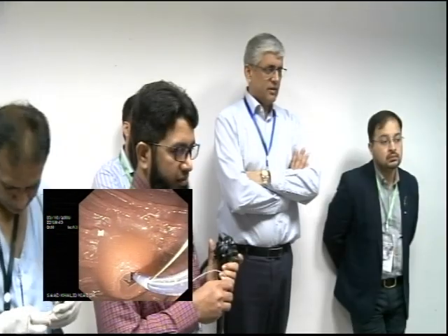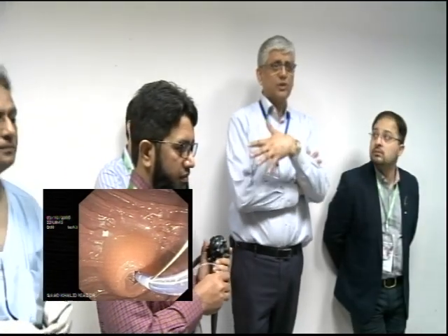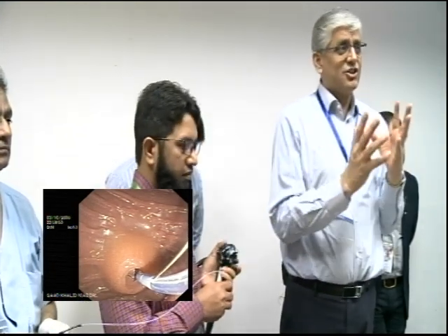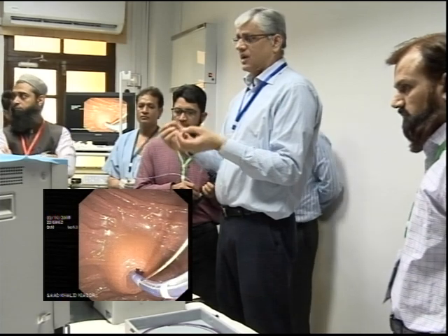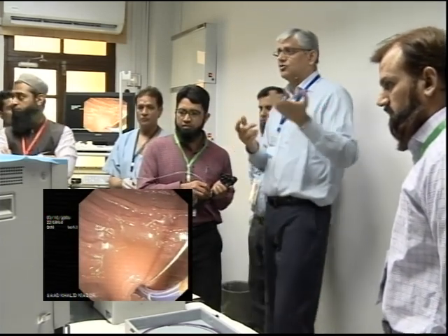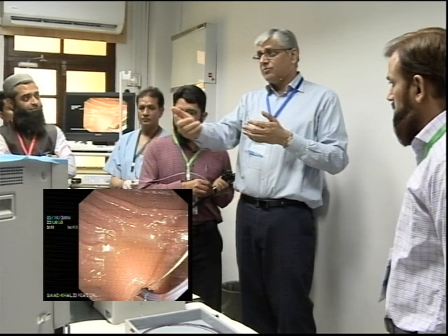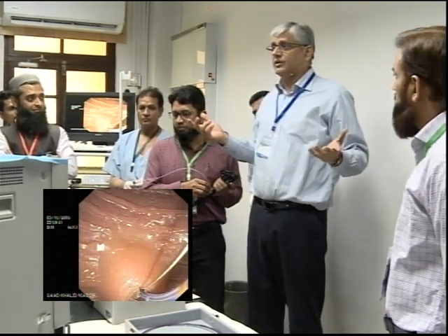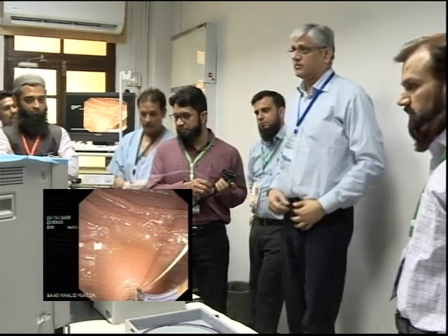Wire back, please. So I want you to talk to the technician. Technician should understand your language. Agar aap kehte wire in, he should know what wire in means. Wire in can be into the scope or wire in can be inside. How does he know? What do you mean? So you need to understand.